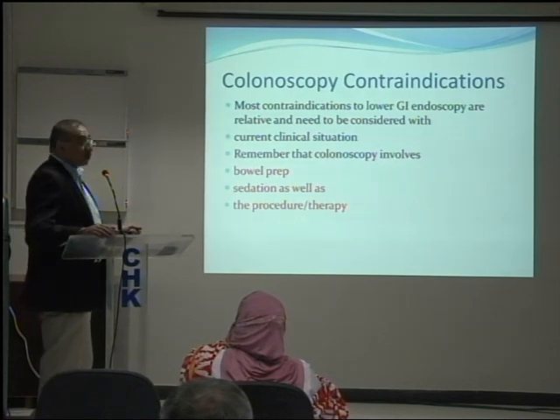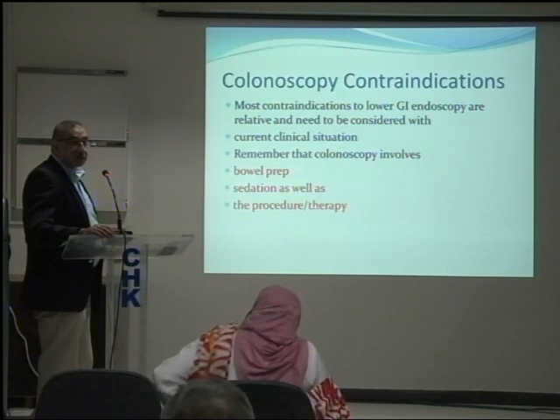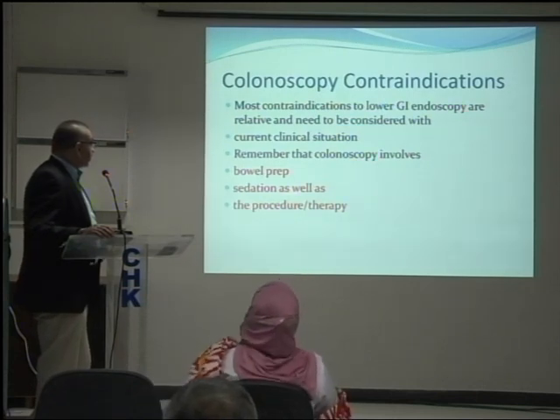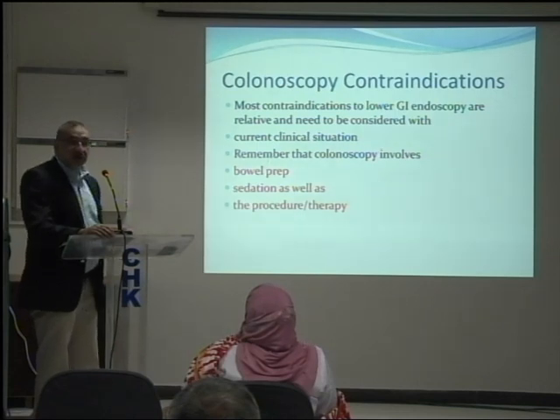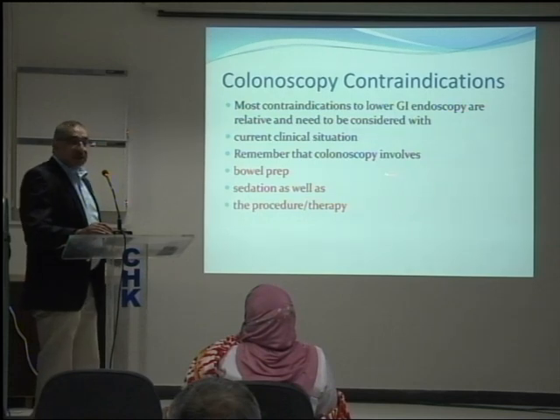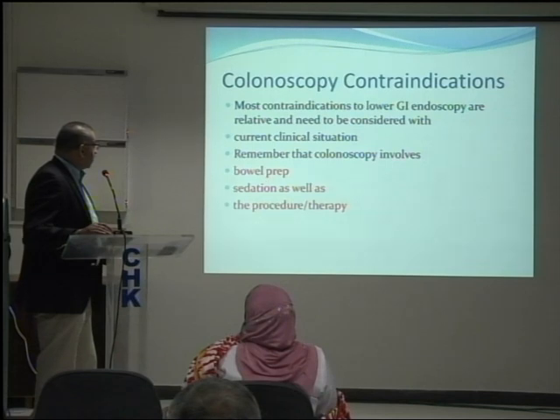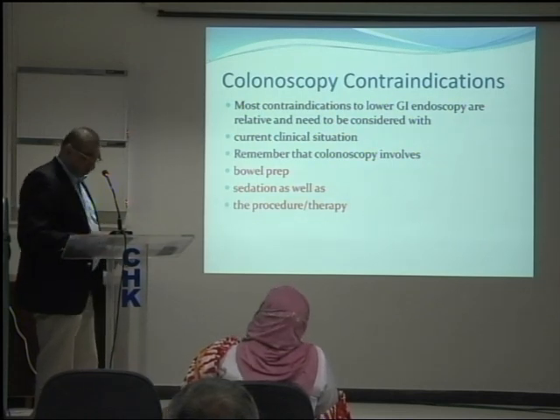The reason for contraindication is because there are 3 different procedures involved in colonoscopy: the bowel prep, the sedation, and the procedure or therapy. If somebody is not well enough to take the bowel prep, you can't do a colonoscopy. If somebody is at risk of sedation, like those with COAD who are frail patients with any respiratory or cardiorespiratory disorders, then if you can do it without sedation, fine. If not, then you shouldn't do it. The procedure or therapy, those who can't.